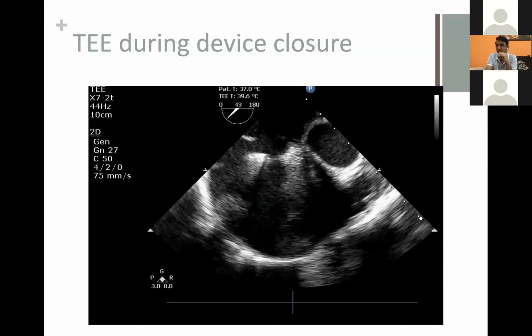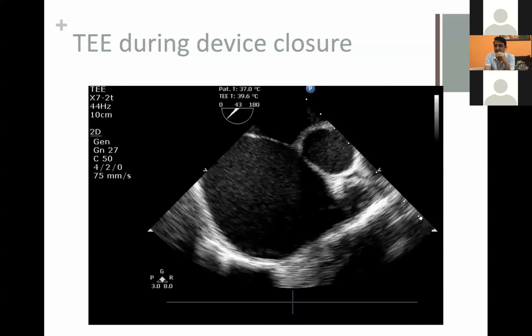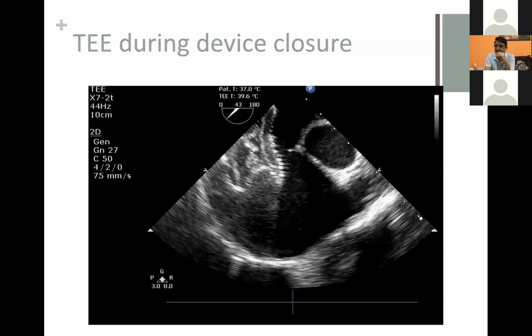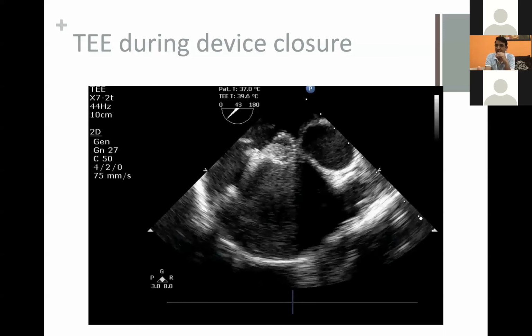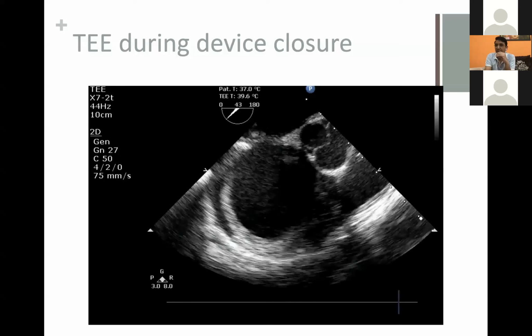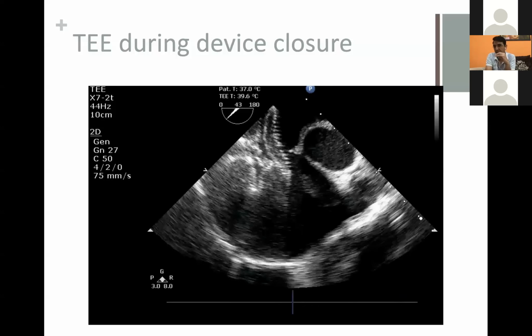So the temporal resolution also plays a role there, because it's a thinner structure. If you can imagine, if the structure is static and you take a snapshot, you have the best chances of picking it up, but it's all moving. So I think as of now, CT is not good for thinner rims and aneurysmal septum.